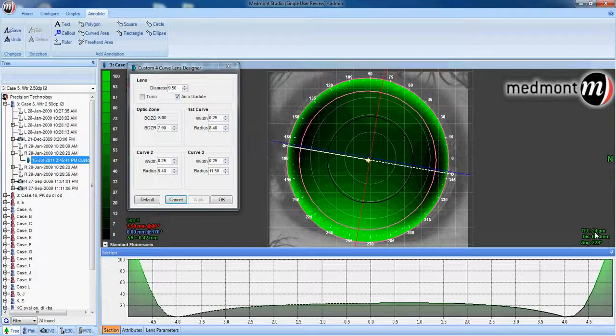For fluorescein to be seen by the human eye, it must be in excess of 20 microns. In other words, for us to see fluorescein behind our slit lamp, we must have a thickness of tear layer and density of fluorescein molecules somewhere in the neighborhood of 20 or more microns. If you want to see a nice even central fluorescein pattern on your actual fit, you must have a tear film clearance at the apex of at least 20 microns. With 24 microns, that would be comfortable. We're looking for somewhere between 20 to 25 on a normal eye.